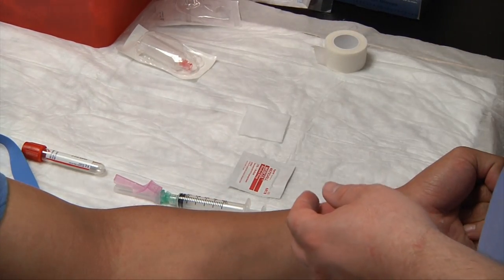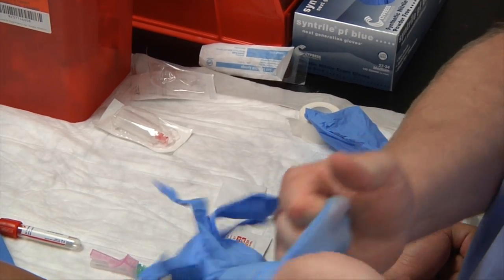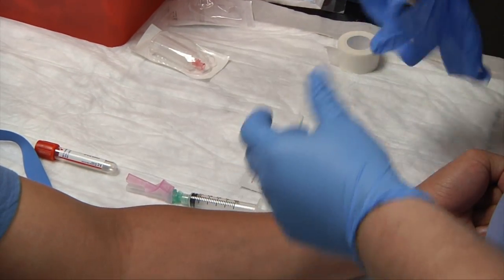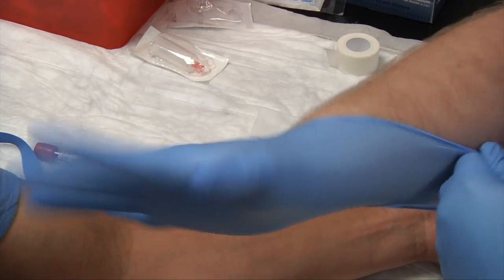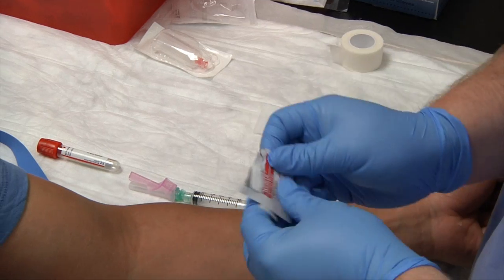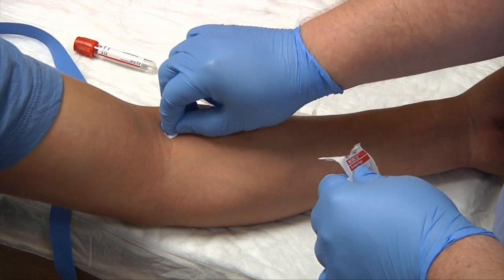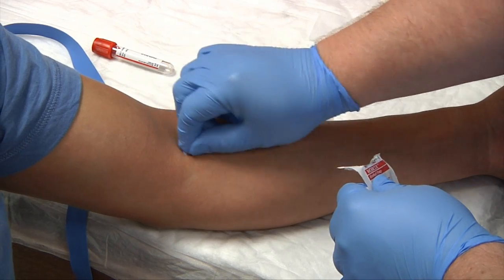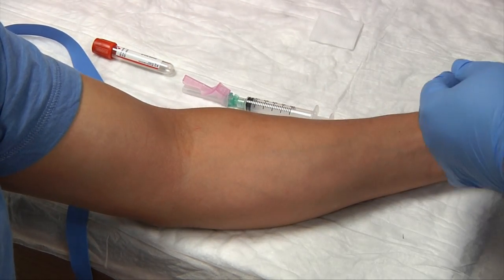We'll go ahead and apply our gloves now. We'll cleanse our patient right before we put our tourniquet back on. Start in the center and use the concentric circle method, working from inside out. Place the swab to the side.